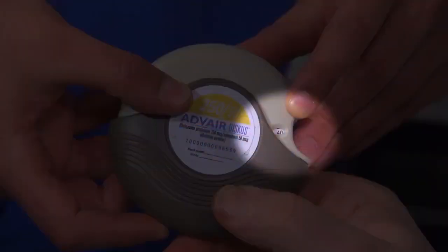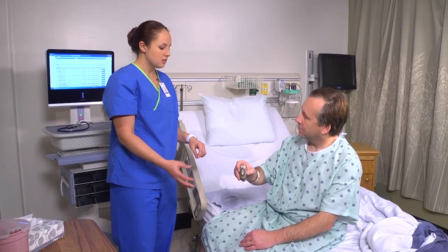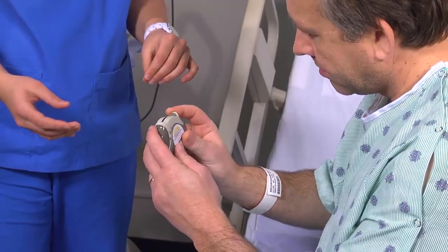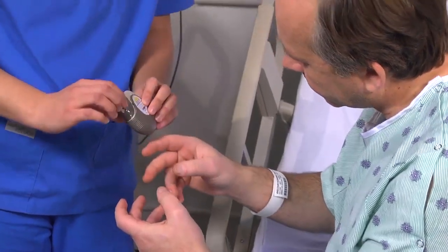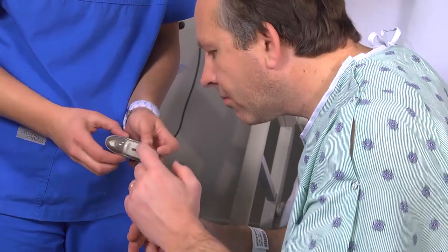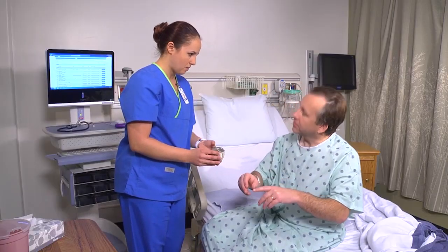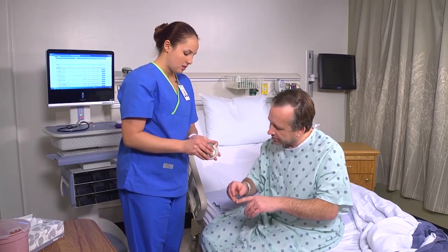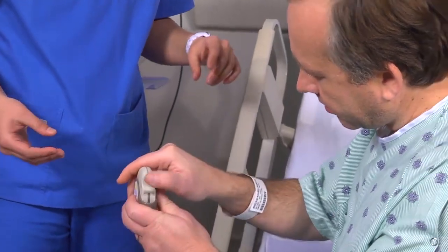Point out the external counter that indicates the remaining number of doses. Demonstrate how the device works, then hand it to the patient and talk him through the steps. Some units require rotating a lever or inserting a capsule or disc into the device. Always follow the manufacturer's instructions for the specific DPI you're using. Don't ever use it more or less than what your doctor prescribes for you.